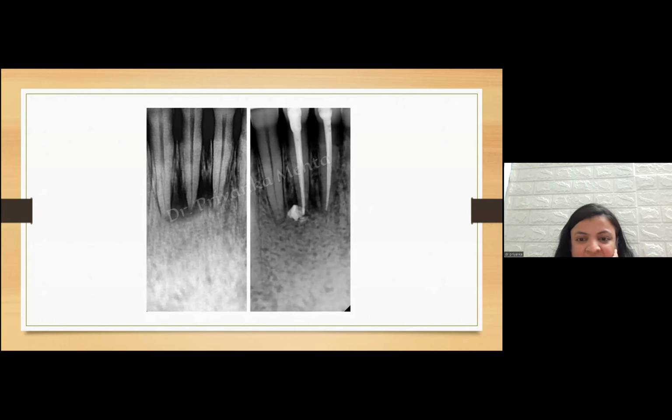Okay, so now this case, when this patient had come to us with a complaint of some other tooth, we saw a discolored tooth in the lower anterior region. I just took an IOPA. There was this lesion formation. Again, I did the conventional root canal treatment proper.